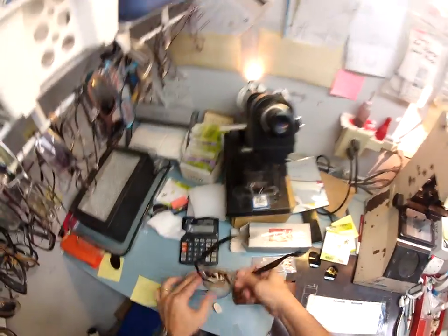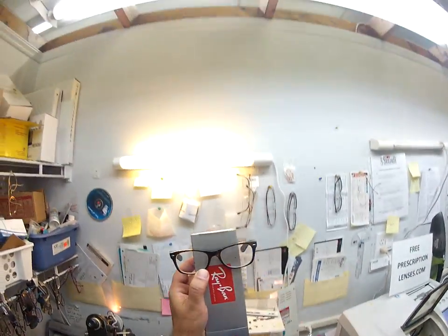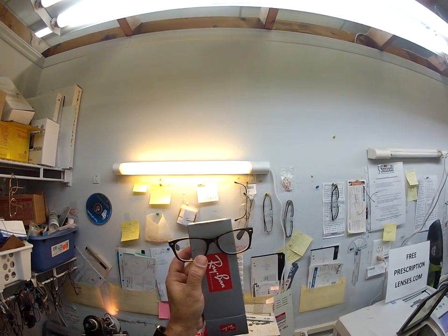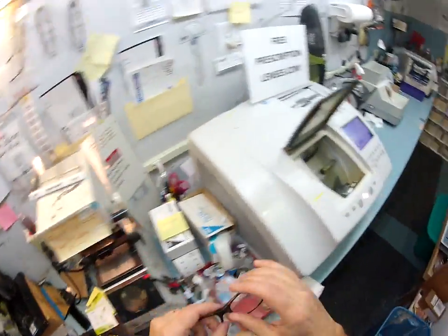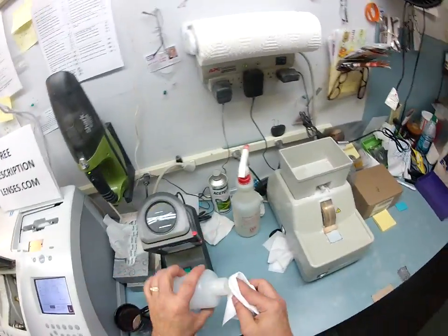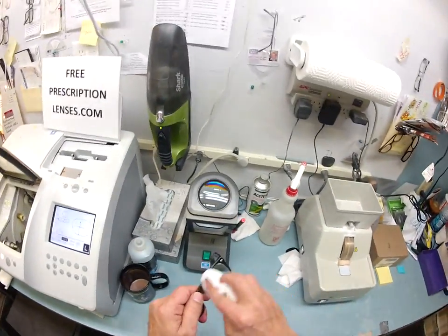I'm going to take this block off and dry this some more. Let me hold up the Ray-Ban case just so you can see those red dots. I'm going to hold up my PD stick and show you that it's 62 millimeters — so we know it's made well. I'm going to use my optical grade acetone to remove the red dots. I'll put a little bit in my hot cocoa, although it's almost cold cocoa at this point.